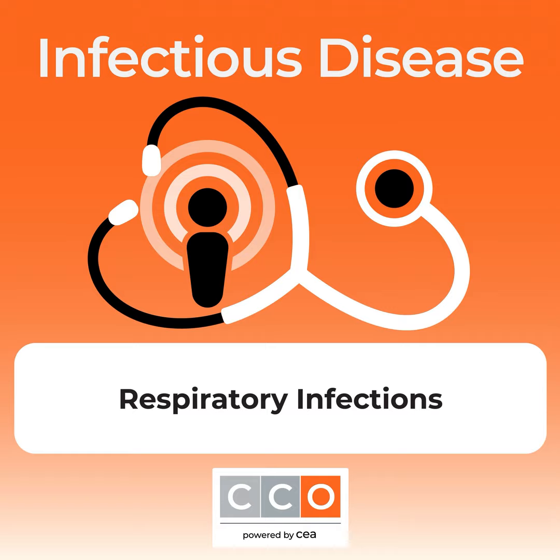This is particularly important for hospital-acquired pneumonia, where resistance is quite common. It's really important for Pseudomonas aeruginosa. So all of the genetic targets that predict resistance on the panel, the carbapenemases, the CTX-M, these are really very uncommon in U.S. isolates, and they provide very little predictive value of resistance in Pseudomonas. Similarly, for Acinetobacter baumannii, although the Univero panel has its carbapenemase OXA-23, the FilmArray pneumonia panel doesn't, okay? So if you don't get culture and susceptibility testing, you're really sort of in the dark about which antibiotics you should be choosing for your patients without susceptibility testing.